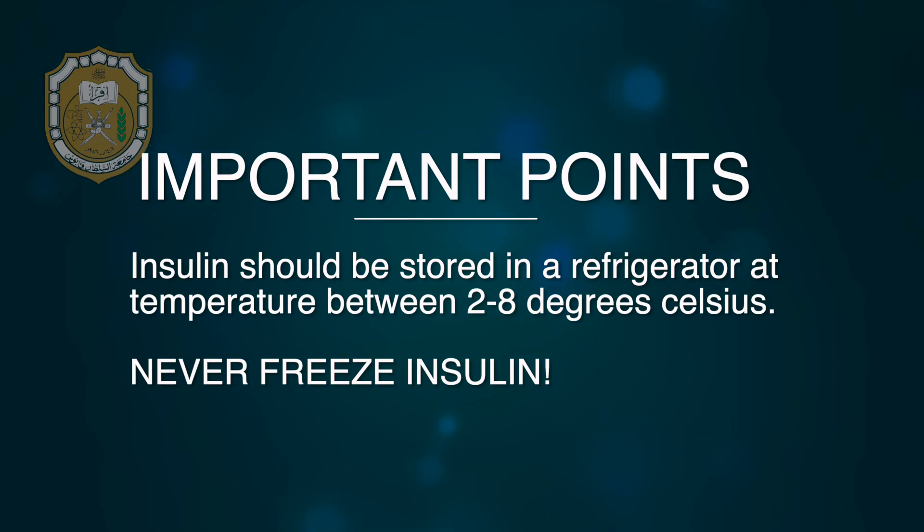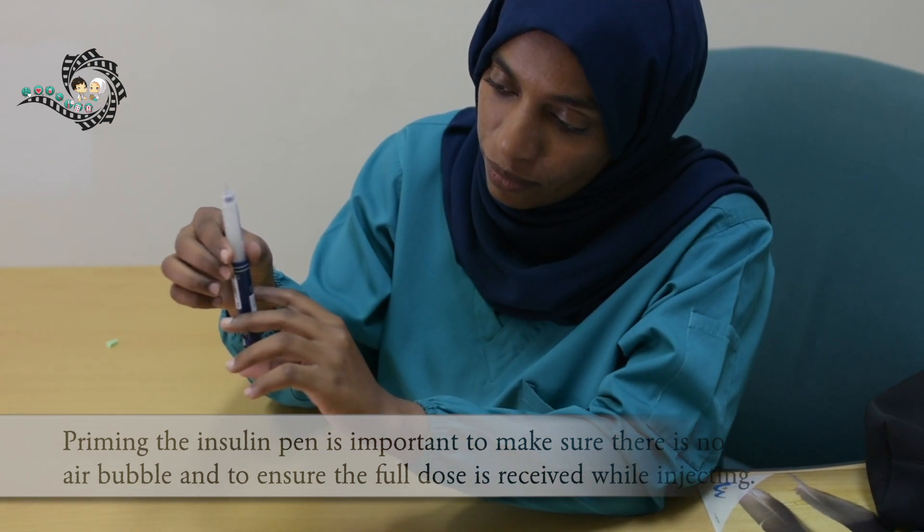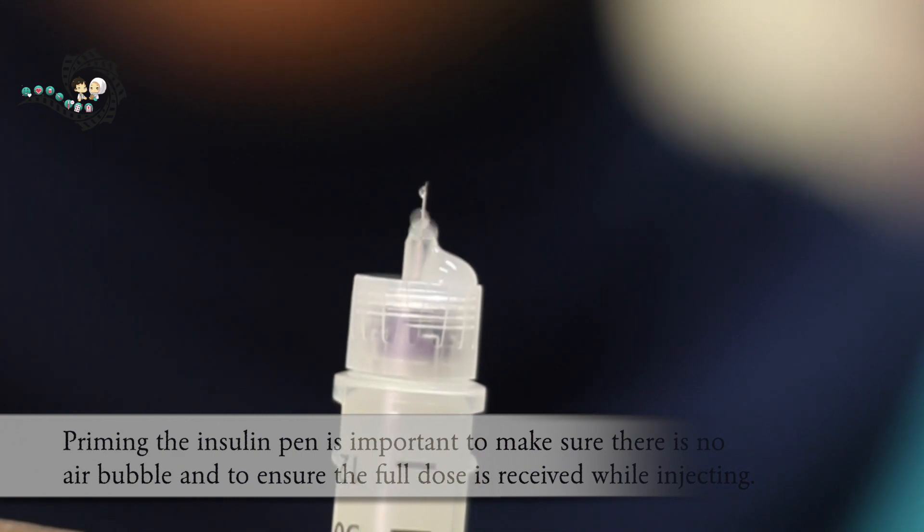Before ending the video, I would like to highlight the following points. Insulin should be stored in a refrigerator at a temperature between 2 to 8 degrees Celsius. Never freeze insulin. Priming the insulin pen is important to make sure there is no air bubble in the insulin and to ensure the full dose is received while injecting.